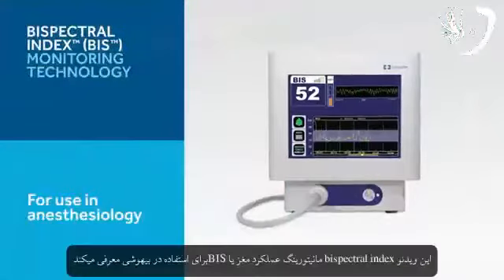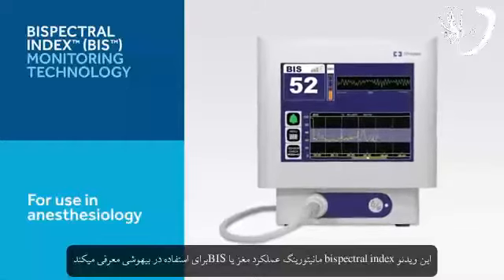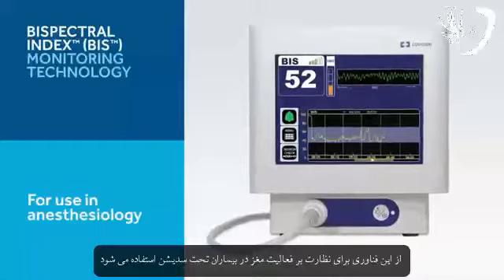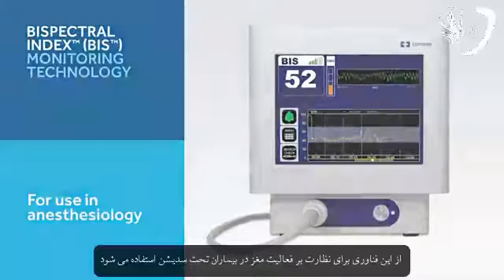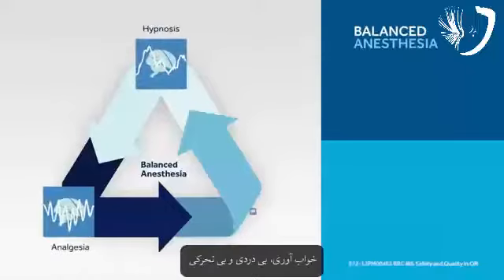This video will cover bispectral index, or BIS, brain function monitoring for use in anesthesiology. BIS technology is used to monitor brainwave activity in patients under sedation. The goal of a clinician is to provide his or her patients with balanced anesthesia. This is achieved by proper management of three factors: hypnosis, analgesia, and immobility.